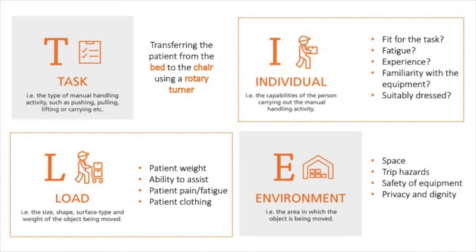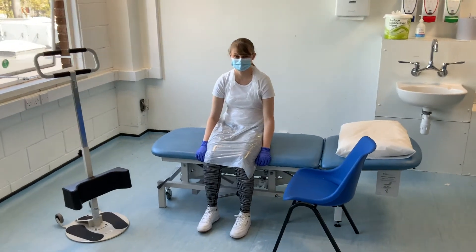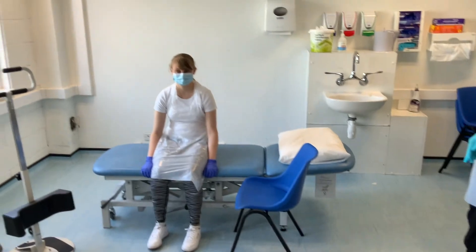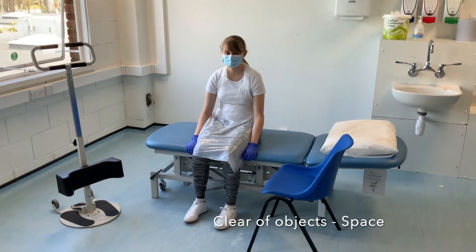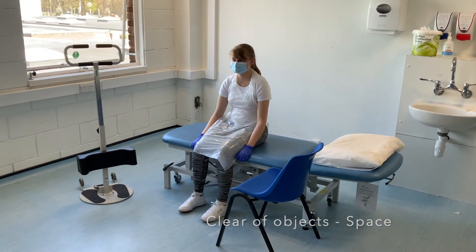L is for load, which is the patient. We checked beforehand and the patient is capable to assist us in the movement. E is for environment, making sure the area is safe and free from objects. Throughout the task we need to maintain the patient's dignity and privacy, maintaining communication throughout and completing short, small bursts to maintain control.